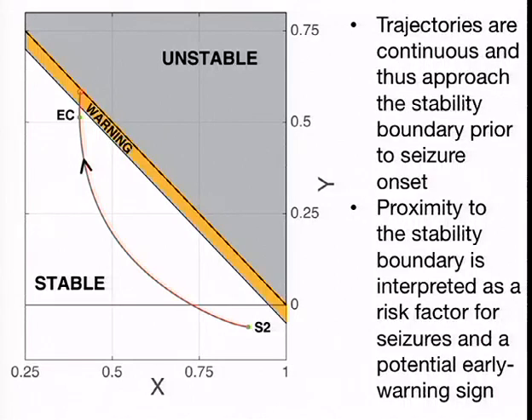Certainly with REM, one of the things that we've found quite interesting is that some of the higher frequencies in the EEG are affected by muscle artifact. So there's kind of an EMG component to the EEG power spectrum, and we see some interesting variations in that over switching between wake and REM compared to the other sleep stages.